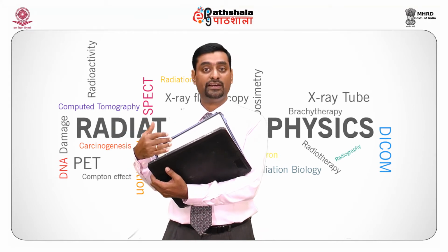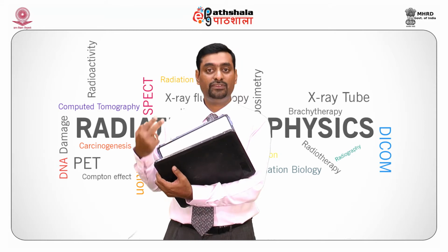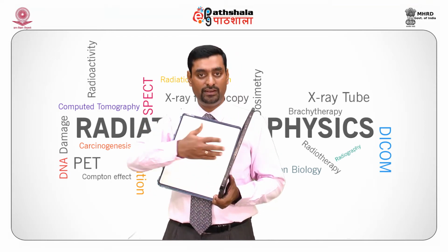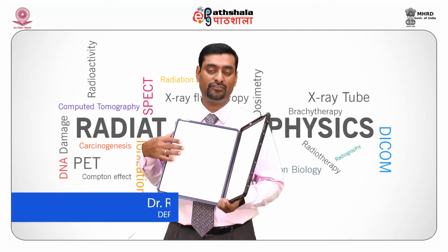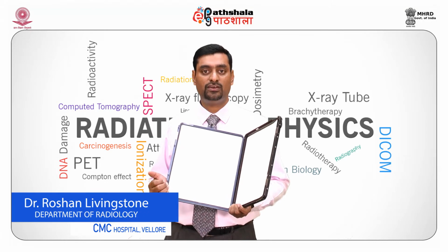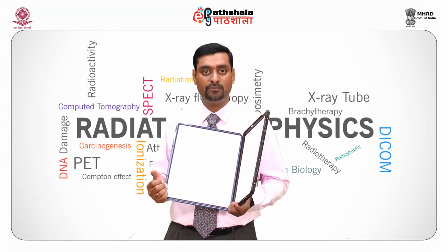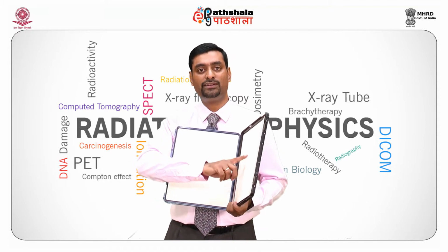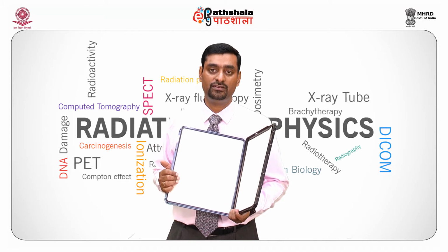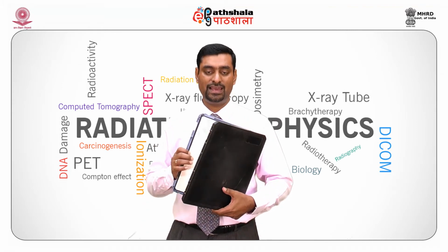The film may have emulsion on either one or both sides. If this is a duplitized film, you have intensifying screens present on both sides of the cassette. For a duplitized film, this kind of cassette is required. But for a single-sided film, we will have only one intensifying screen so that the image quality is better.